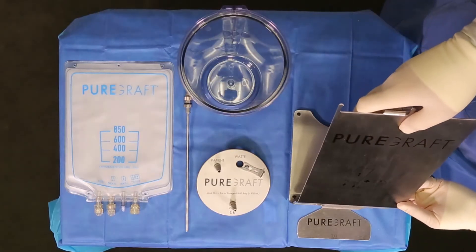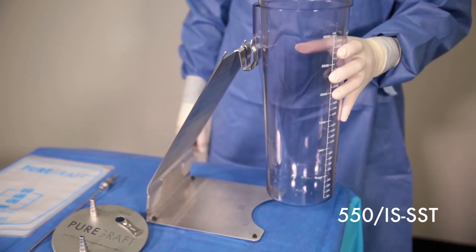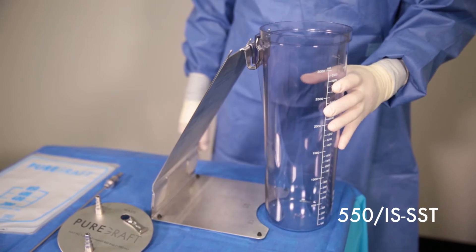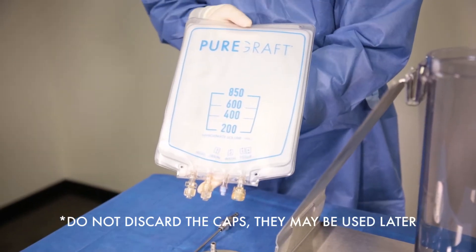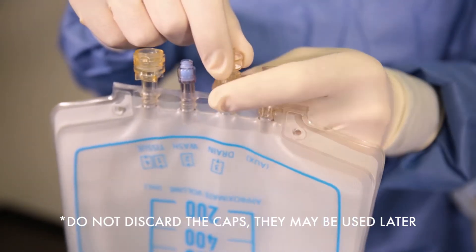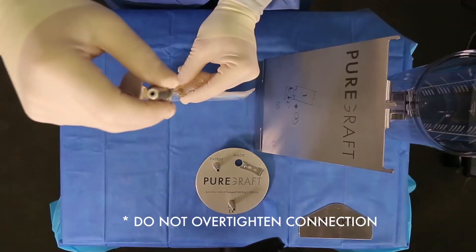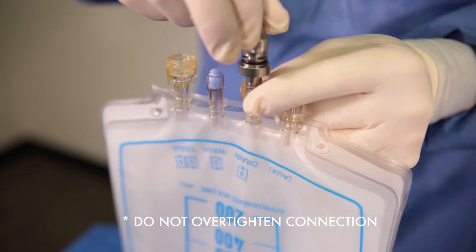After opening the items on the sterile field, assemble the easel and slider. Next, connect the 3-liter canister to the back of the easel. After opening the PureGraft 850 on the sterile field, remove the caps from the 850 system and carefully insert the metal drain straw into the drain port on the PureGraft 850.